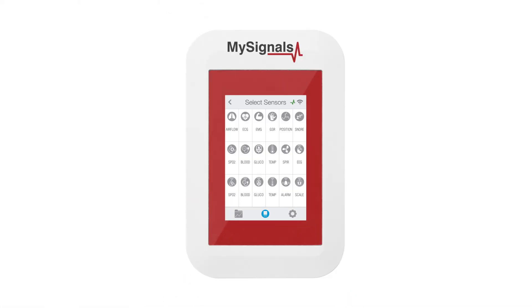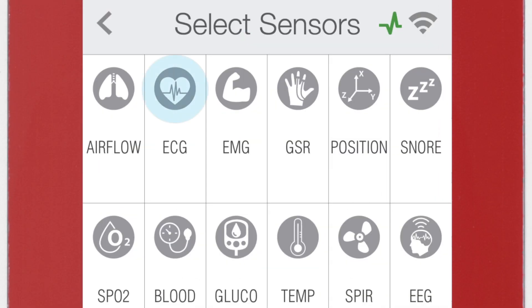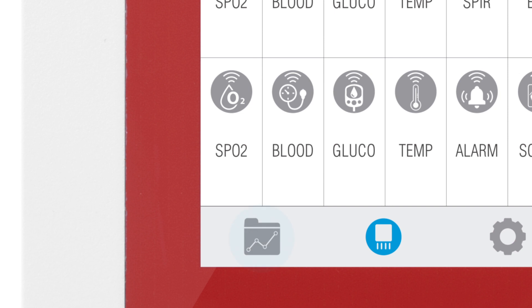In the Sensor Selection screen, you can see all the sensors available. By selecting the ECG sensor, the icon will turn blue. Then click on the Data button to access the data screen and start visualizing the data.